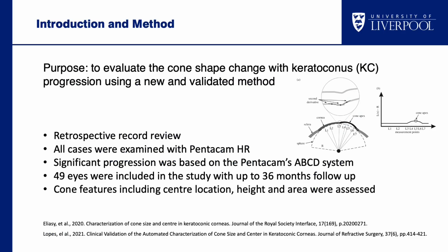The purpose of this study is to evaluate the cone shape change with keratoconus progression using a new and validated method. This method was previously discussed in detail and published at Royal Society Interface, and further it was applied on clinical data and validated clinically, and this was also published at Journal of Refractive Surgery. Both of these publications are referenced on this slide.